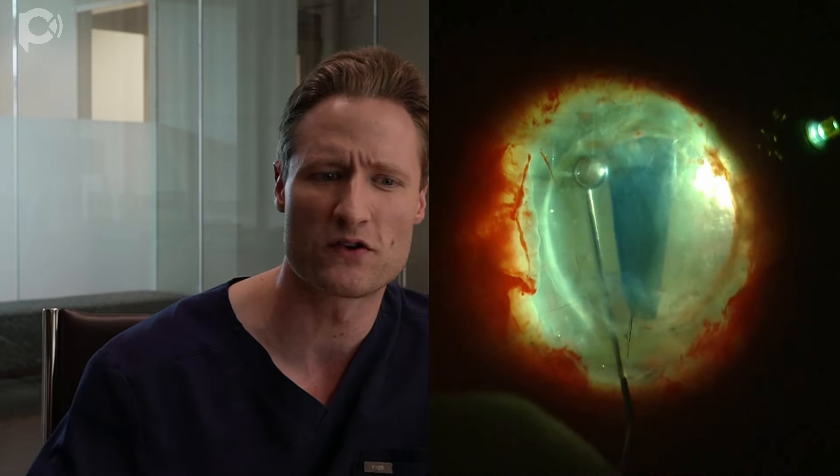My visibility here is facilitated drastically by the use of this chandelier illuminator. I've got the microscope light off and the chandelier illuminator in the pars plana, and the graft just carefully glides out into the anterior chamber on top of this trampoline web. I notice there's a bubble in the anterior chamber, and the first step is to remove it, because the bubble competes with me for control over the tissue and makes it more difficult to assess what's going on with the edge of the graft.